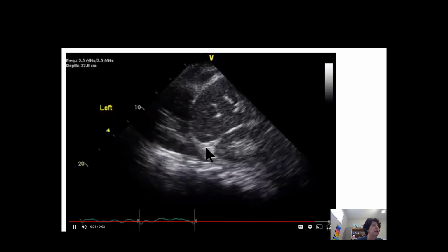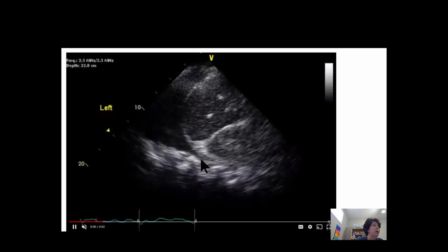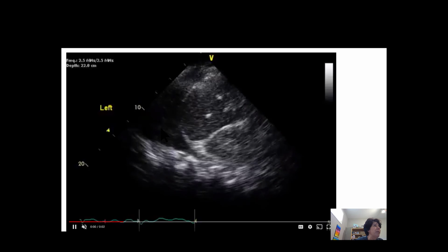And then going on to the other side, we have left pleural effusion. So this would be the spleen and the spleen-kidney interface, again with the spine continuing beyond that diaphragm. That is your positive spine sign. And you can start seeing some atelectatic liver-looking tissue like a lung peeking through here, which is collapsed lung base on the left.